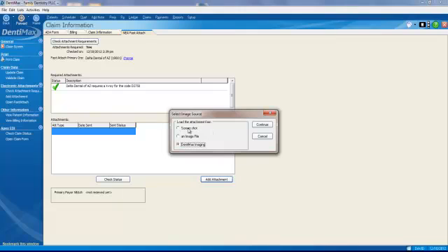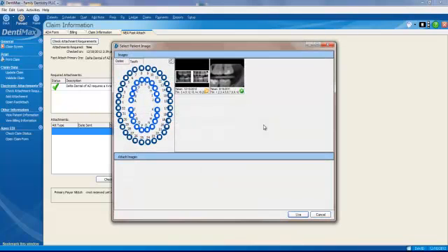There are other options. We can do a screenshot or pull it directly off the file. In this case, though, we're going to take it from our imaging software. We'll click on Continue.